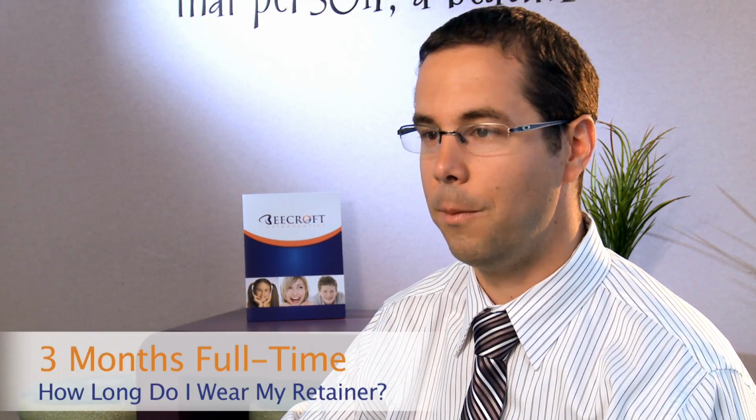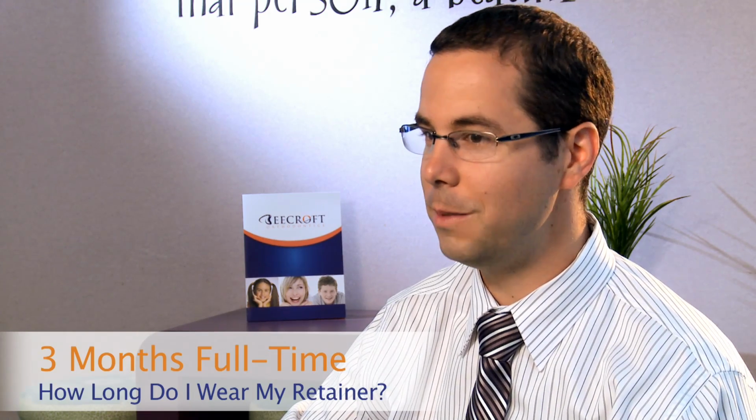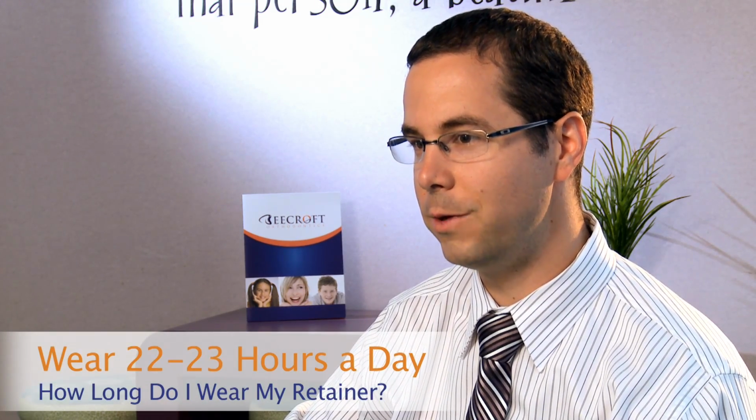Big question I get is, okay, so how long do I have to wear them? We ask patients to wear the retainer for 3 months full time. Now again, those first 3 months are the months when those teeth are going to tend to move the quickest. So 3 months full time, you're taking the retainer out to eat, you're taking it out to brush, and you're taking it out for special occasions, big dates, public speeches, things like that. But other than that, you want them in at least 22 to 23 hours a day. And you'll notice that if you take it out, those teeth will move pretty quickly.